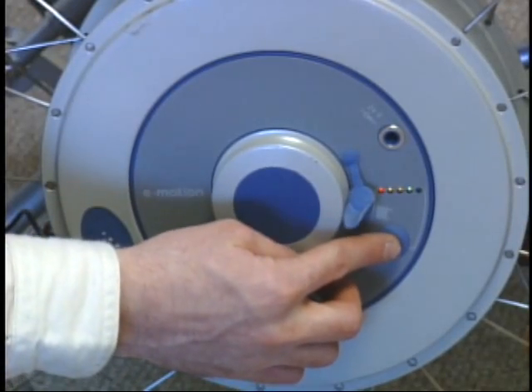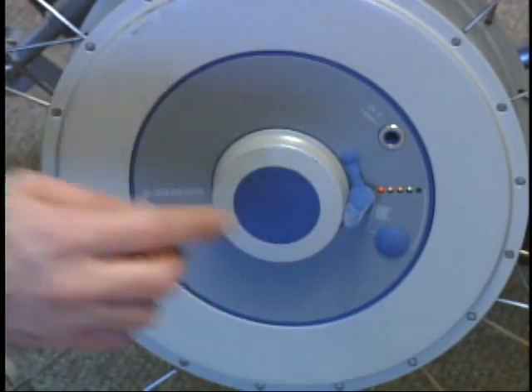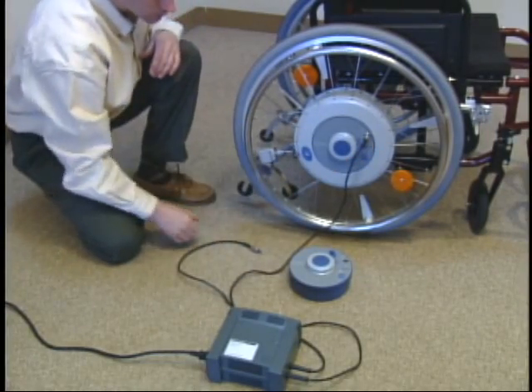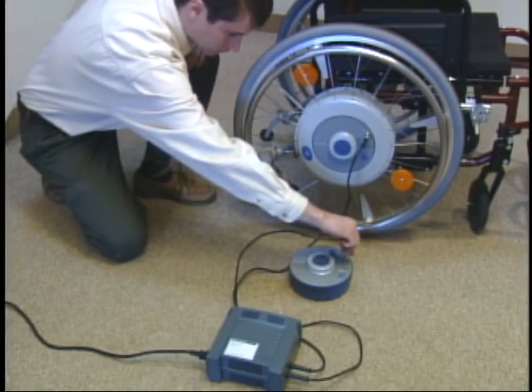Control lights display the current battery charge. The batteries may be recharged either when they are on or off the wheelchair with the automatic battery charger.